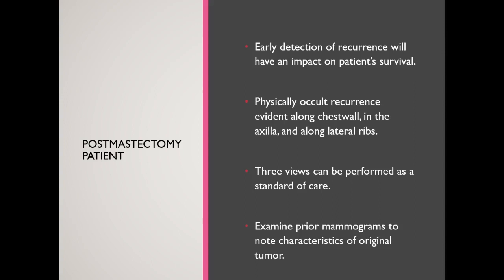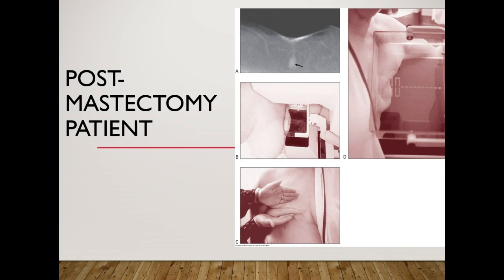Standard views for these patients would be your CC and MLO projection. You may need to do a spot magnification in an area of interest or additional imaging to include the axilla, so an axillary tail of the breast view or exaggerated CC to show that part of the breast.